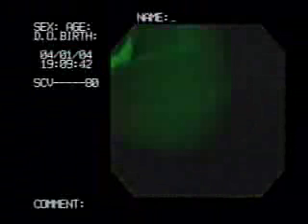A fiber optic bronchoscope will be used to examine the patient's lungs and obtain tissue for pathological diagnosis. The patient is placed under general anesthesia and the fiber optic scope is passed down the endotracheal tube into the windpipe or trachea.